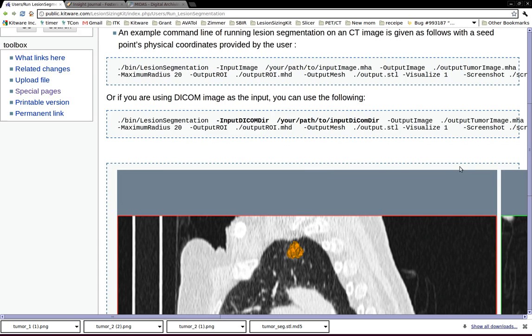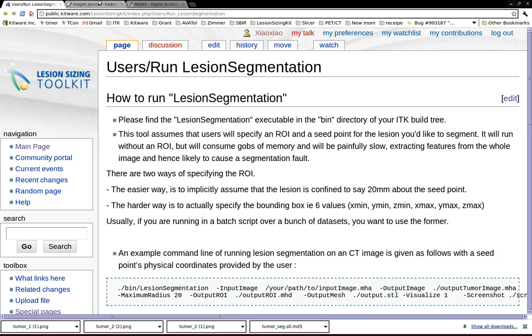To make this whole process easier, I think it might be helpful to show how I build Lesion Sizing Toolkit with ITK v4.